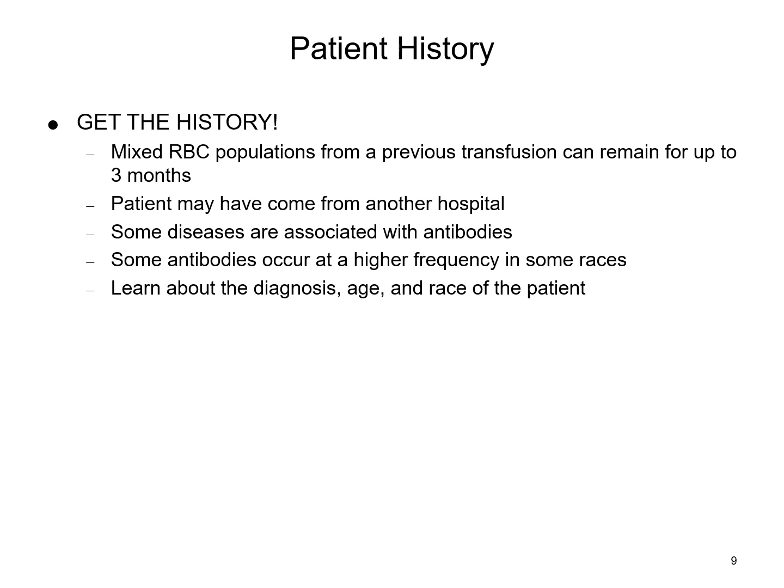while that's incubating and you're going through those steps, before you enter your patient results, or when you're entering patient results, or investigating anything, you're always going to check your patient history. Now, why is it important to check patient history? Well, that's going to give you a lot of valuable information to help you with determining what you're going to do with that patient.